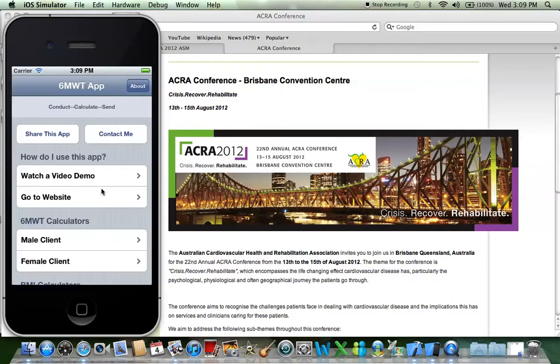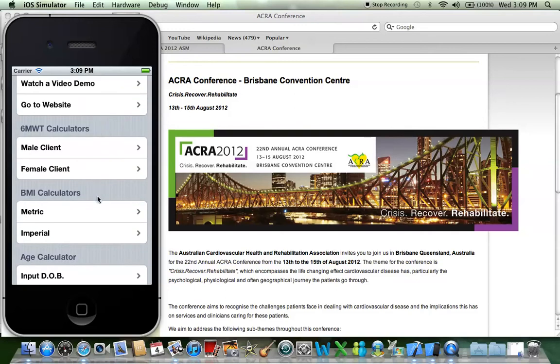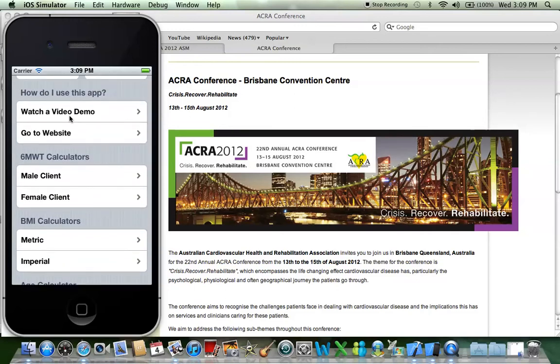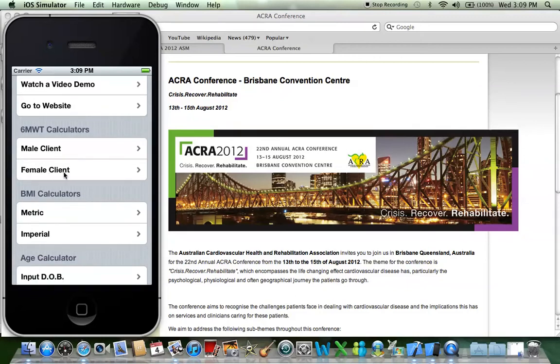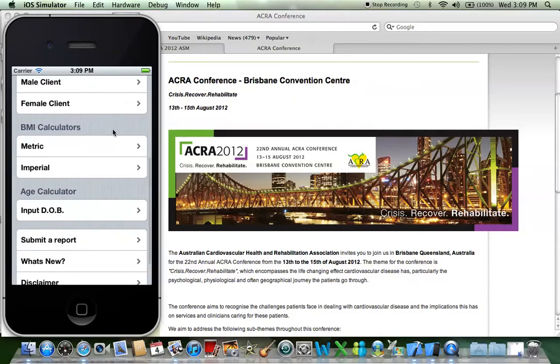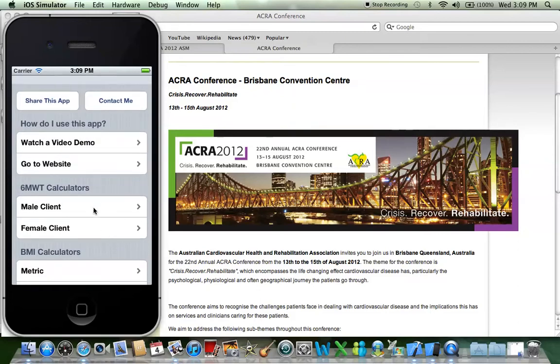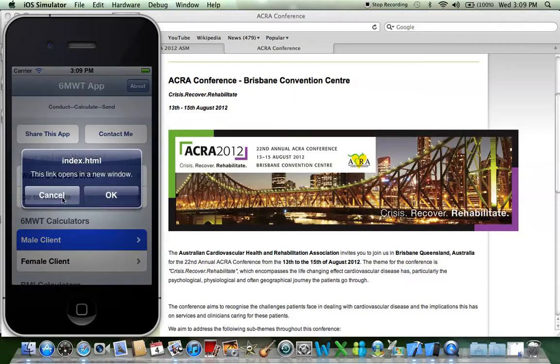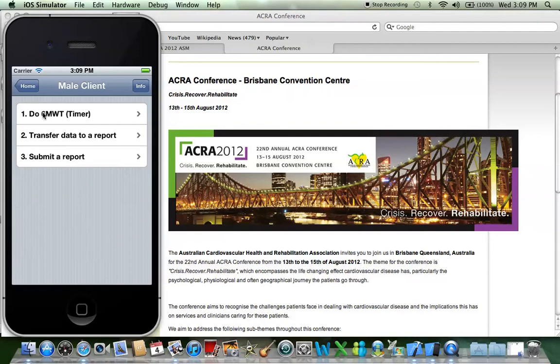Let's do an example of a male client who is diabetic, and it's his initial assessment, or as we like to call sometimes a pre-assessment. As you can see here, you can watch a demo video, go to my website, conduct a six-minute walk test depending on which client you have, calculate your BMI and age, and also submit a report. Let's start off with the male client who is diabetic — it's his initial assessment. We'll go to male client, and let's do the first step, which is to do a six-minute walk test.